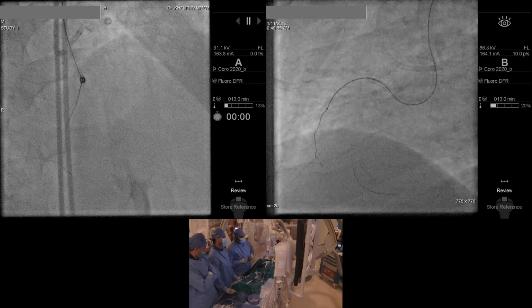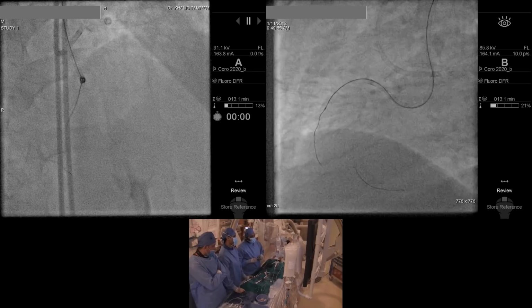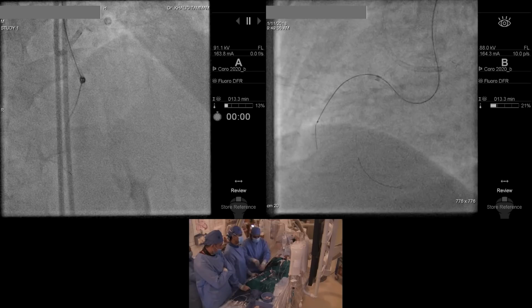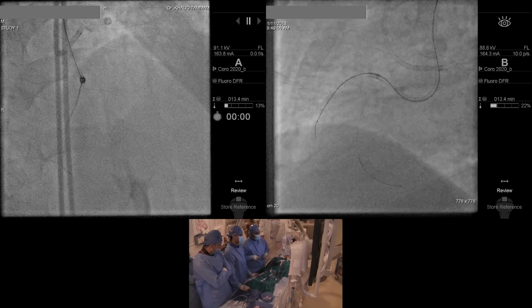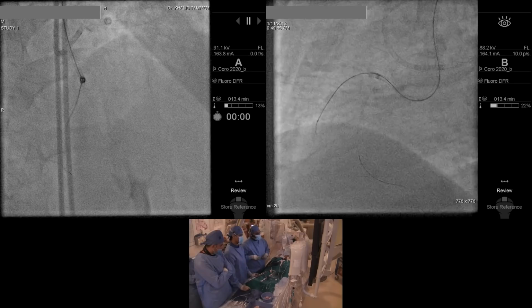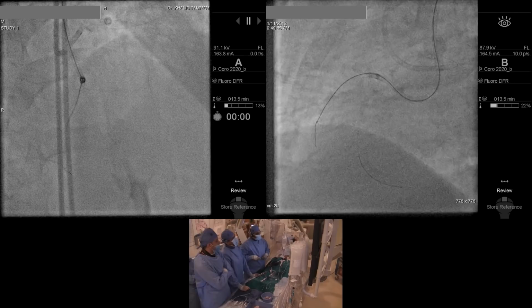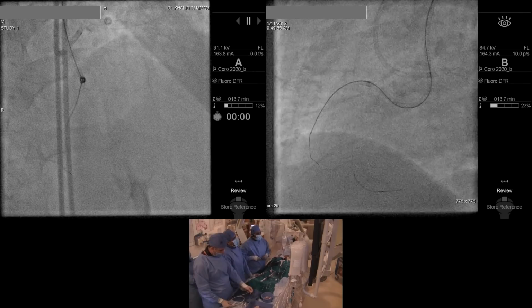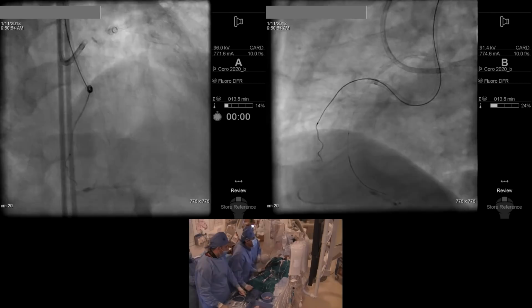Try to get the microcatheter inside. Now we have some purchase of the wire in front of it. Yeah, the microcatheter is going smooth. The XTR will not be in the false lumen without making a knuckle. So I think it's either a side branch or true lumen. So I think here we can take another wire, to see whether you are really in the projection. I think you are in a side branch, right? Yes, we are absolutely.